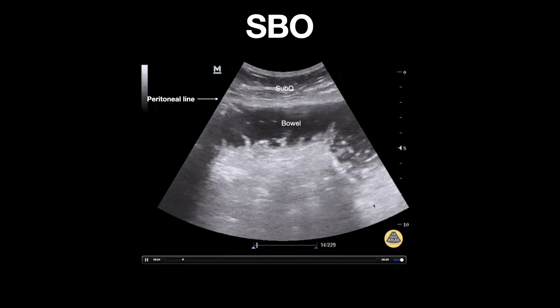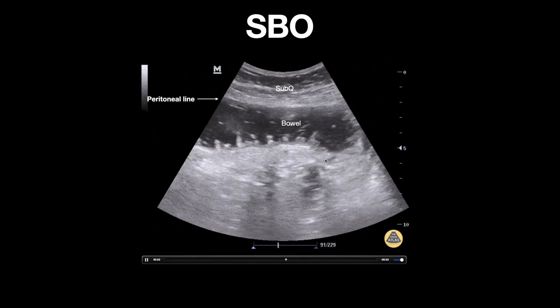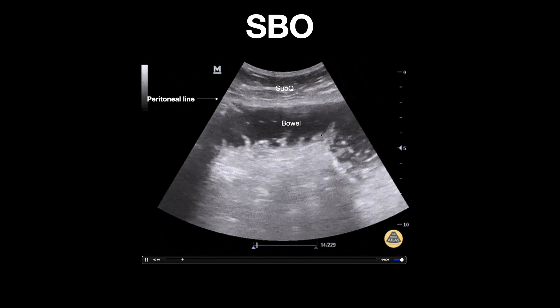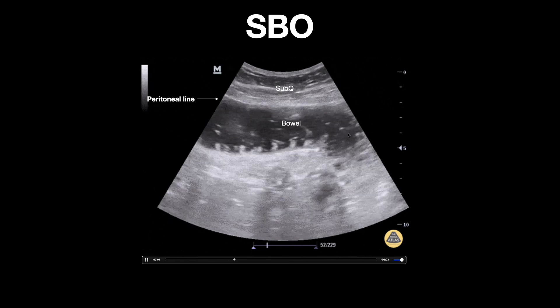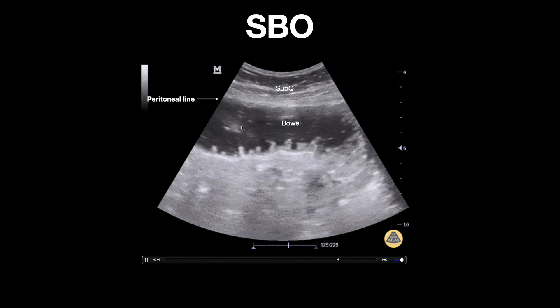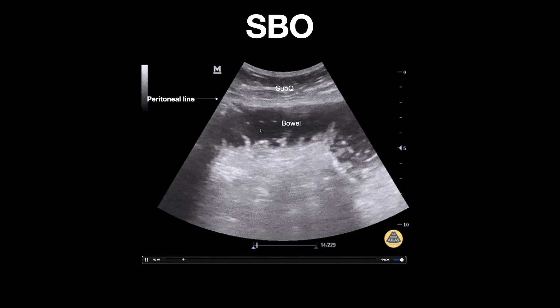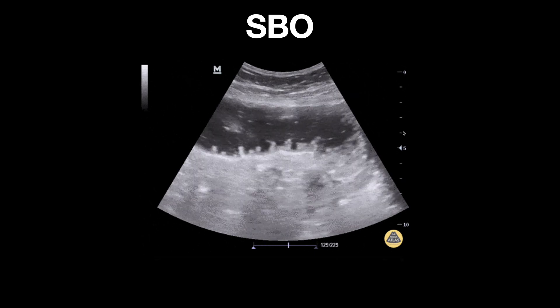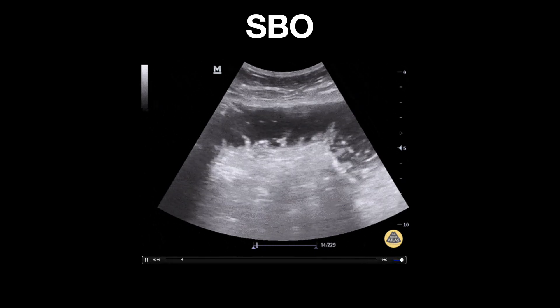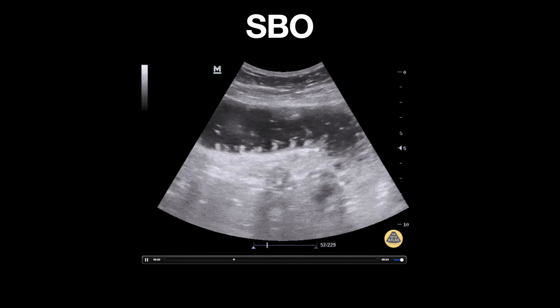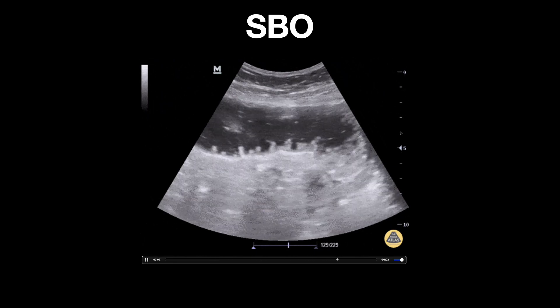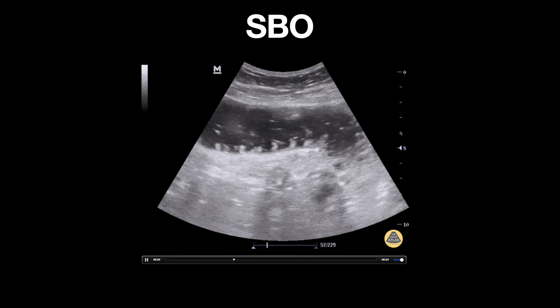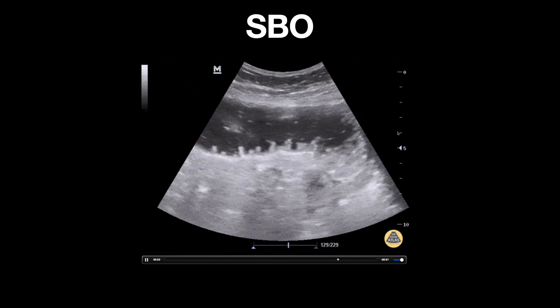In this clip, we can appreciate a dilated bowel loop. Notice this structure here, which is seen pushed up against the anterior abdominal wall. This is small bowel. Normally, the small bowel is not well visualized on ultrasound due to it containing air. However, if a small bowel obstruction occurs, it becomes fluid-filled and more visible.